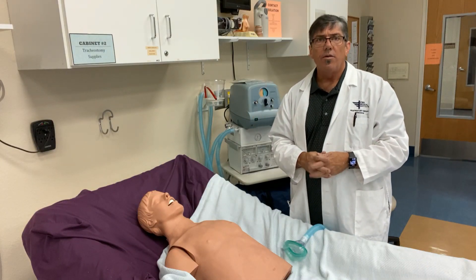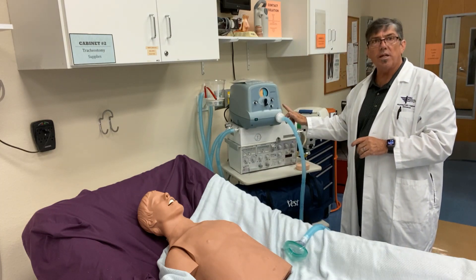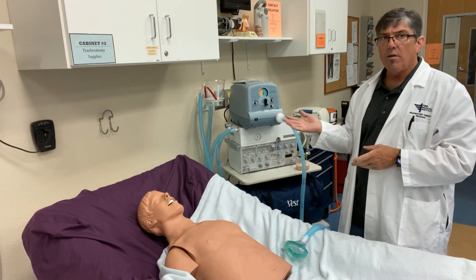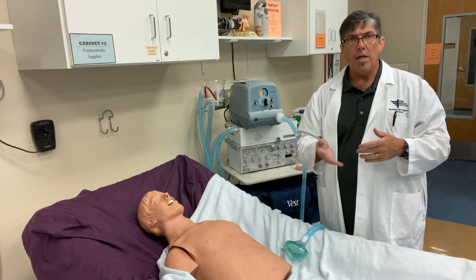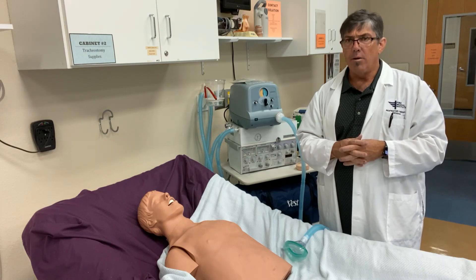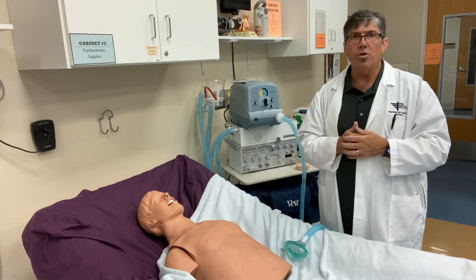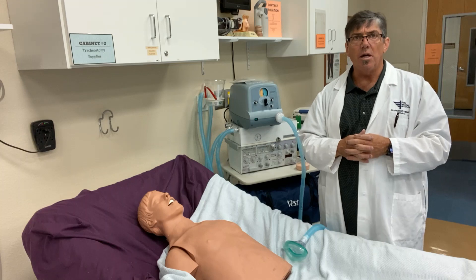Hello everyone, Chris here. Today we're going to take a look at the cough assist insufflation exsufflation device — very helpful in secretion removal. I've had experience with the cough assist with paraplegics and quadriplegics that we were managing to remove slowly from the ventilator. We could provide this therapy to help expand the lungs, and on exhalation there's a negative pressure that helps pull secretions and helps the patient cough. So we're going to demonstrate the cough assist.